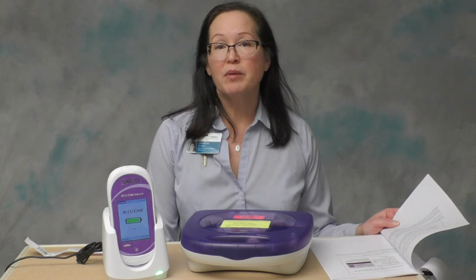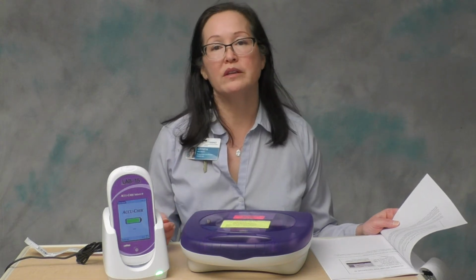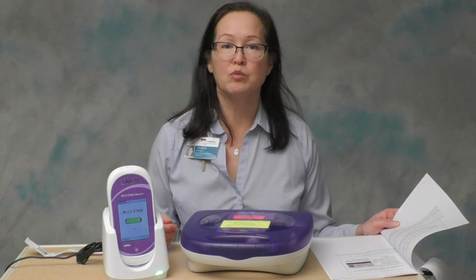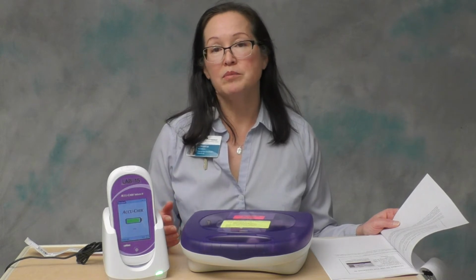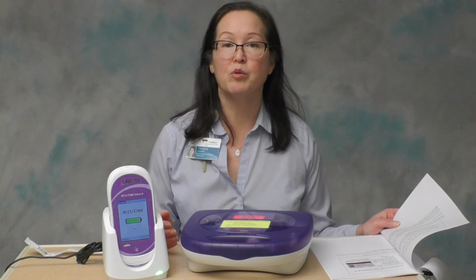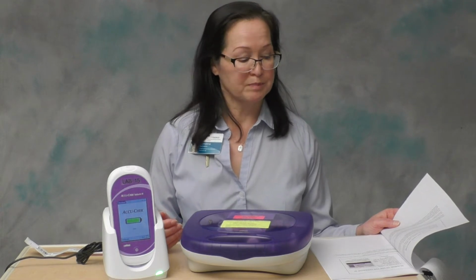These are sent to us by outside testing agencies, and even our department does not know what the true test result is. So we'll bring them to you, ask you to treat it like a patient sample and run the test. We submit it and are expected to obtain 100% on our proficiency testing. Anything less than 100%, then we're required to come back and do retraining and retesting with those users.